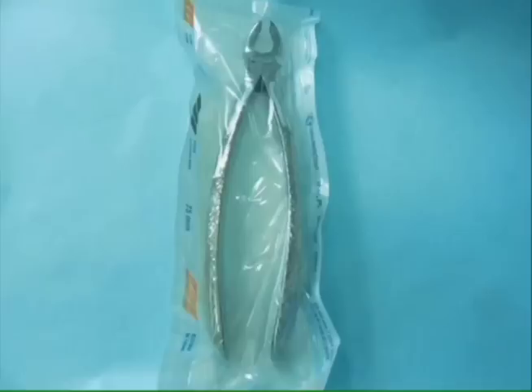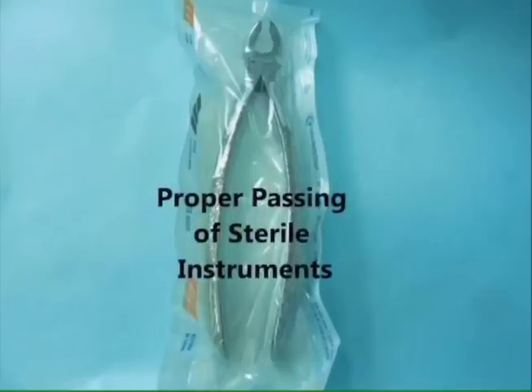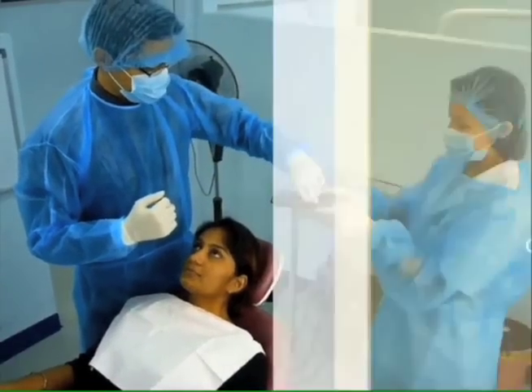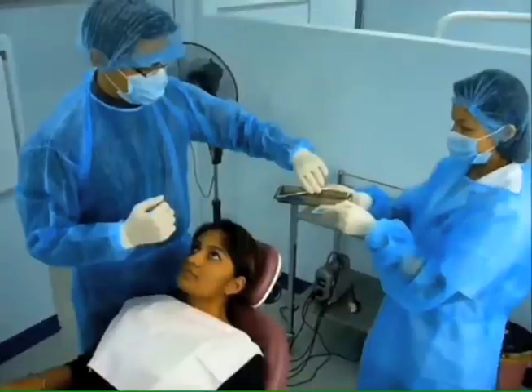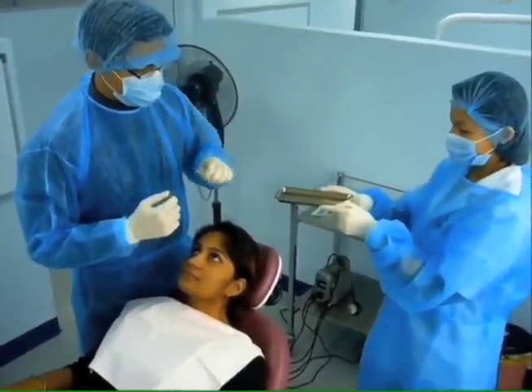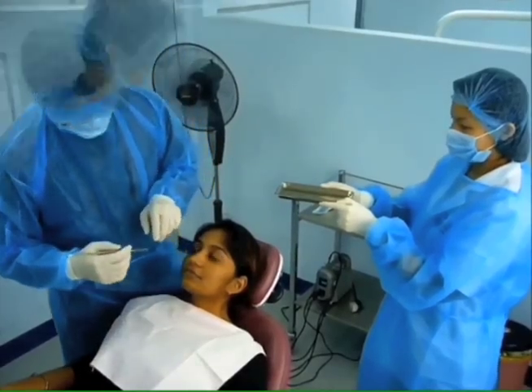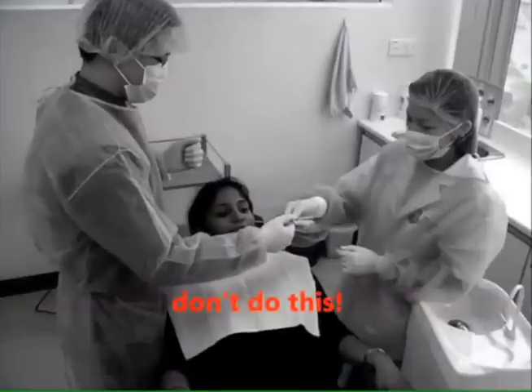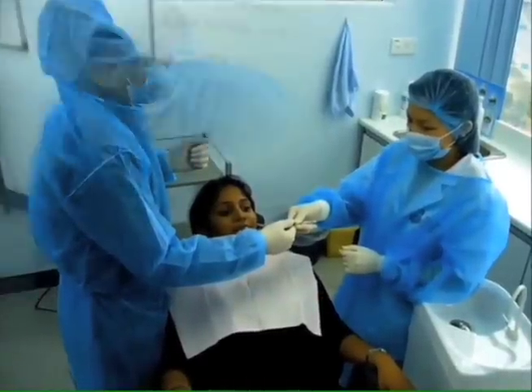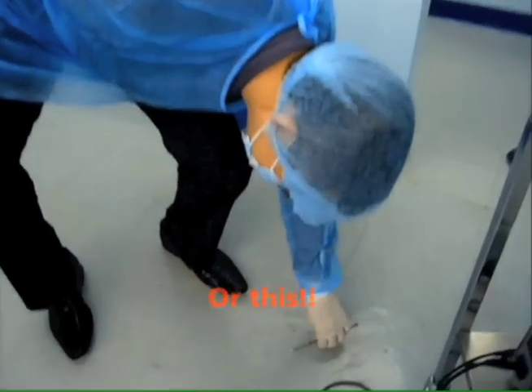Work practice control. Proper passing of sterile instruments. Passing of sterile instruments is done by placing them onto a tray, which is then handed to the operator. Instruments should never be passed by hand or picked up from the floor.